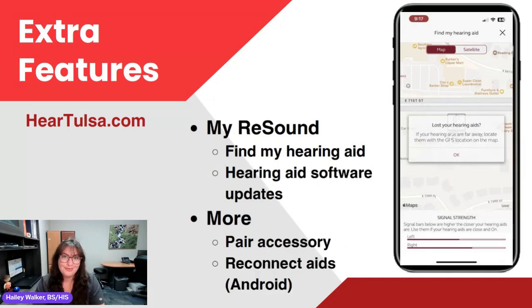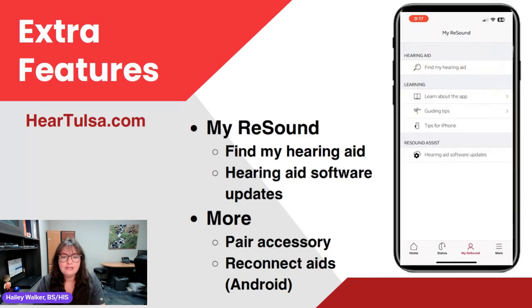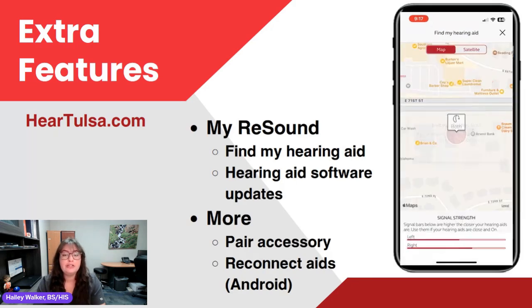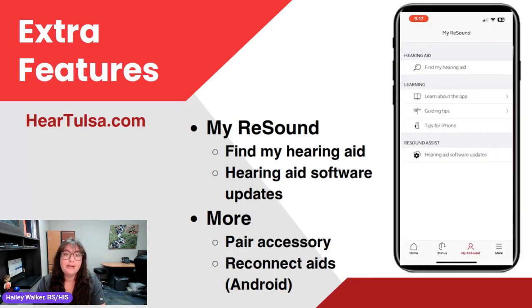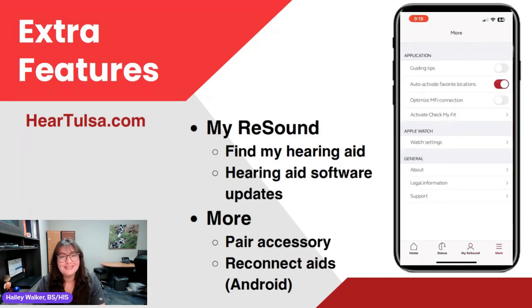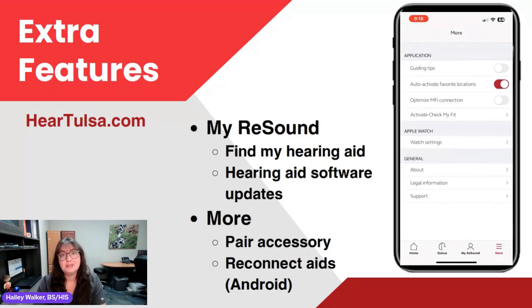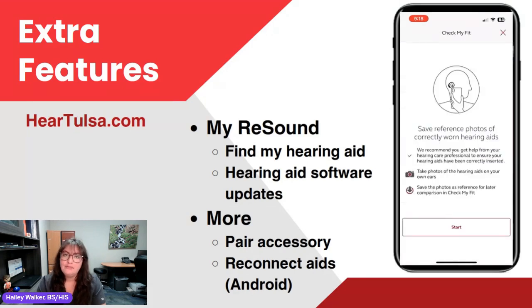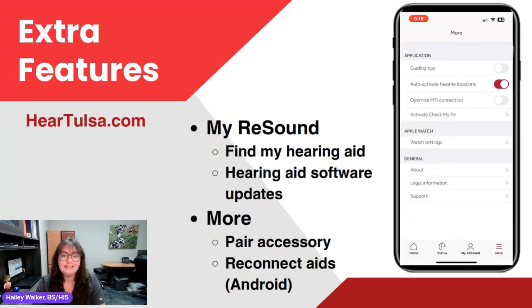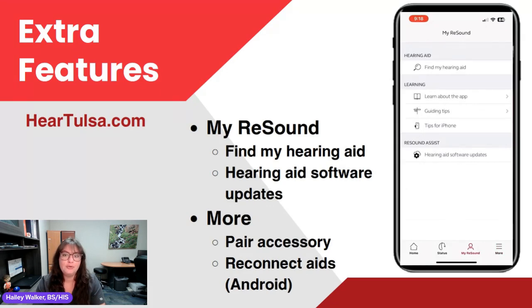The next tab from status is my ReSound, and the one after that is more. In my ReSound, if we have location services on, that's where we'll find our hearing aids on a map view if we lose them. My ReSound also has software updates — if your hearing aid needs an update, you can check it there. Sometimes notifications will alert you, or your hearing care professional will be notified when they hook up your hearing aids to the software.